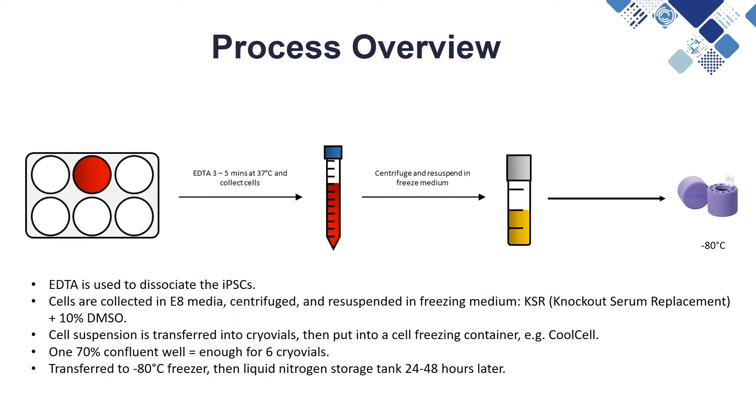After dissociation the cells are collected in E8 media. They are then centrifuged and resuspended in the freezing medium. For this we use KSR with 10% DMSO. DMSO is a type of cryoprotectant which slows the cooling rate of the cells and helps to prevent cell death.